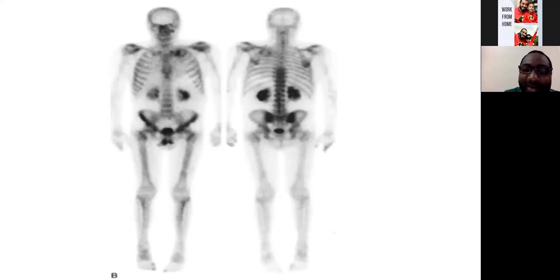In diagnostic radiology, if you ask for an additional view, you are exposing the patient to radiation. In nuclear medicine, if you ask for an additional view, the technologists will be crazy at you because you are wasting time. So time is critical. With the same single dose, you can do your three-phase bone scan, you can do your whole body, you can do statics, you can do SPECT CT, you can do everything, even if the patient's problem is in the finger. It's the same dose that the patient gets. But what you are wasting is time.